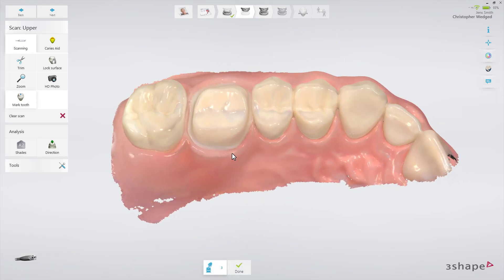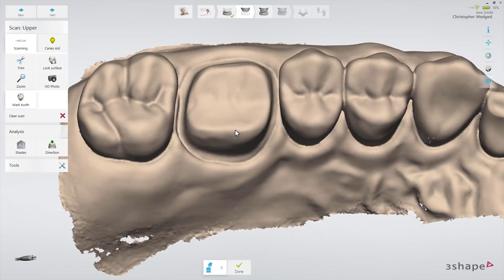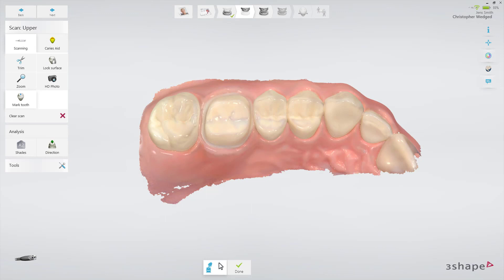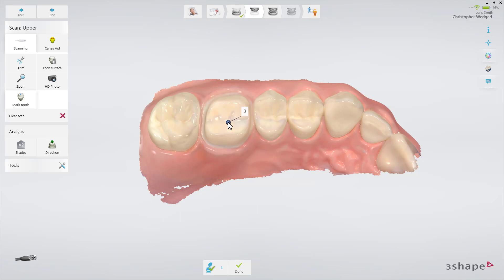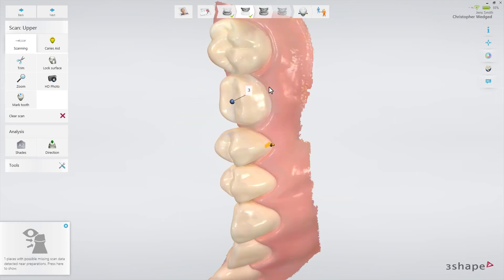Verify this by zooming in on the preparation, turning off colors, and rotating the preparation. Finally, mark the preparation using the mark tooth button. Once you have marked the tooth, the software will automatically check if there are any areas near the preparation that have not been scanned. If any holes are found, you'll be informed by a pop-up. Pressing the pop-up will rotate the scan to show the areas not scanned, indicated by amber arrows.